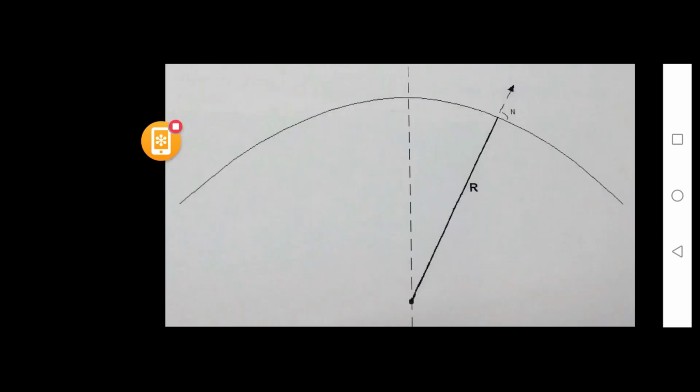Right. Now, how is the axial map calculated? Let me tell you. So, let's suppose this is the cornea. Over here is the cornea. This is an optical axis, the dotted line that you see. Suppose this is our point of interest, and I want to find out the dioptric value at this region. So what it will do is it will just measure the distance from this point of interest to the optical axis. The one assumption which is made over here is that the cornea is a spherical surface, because there is a fixed optical axis which is being used.